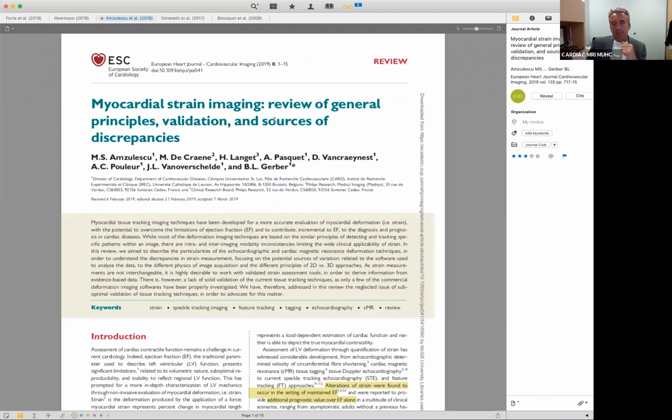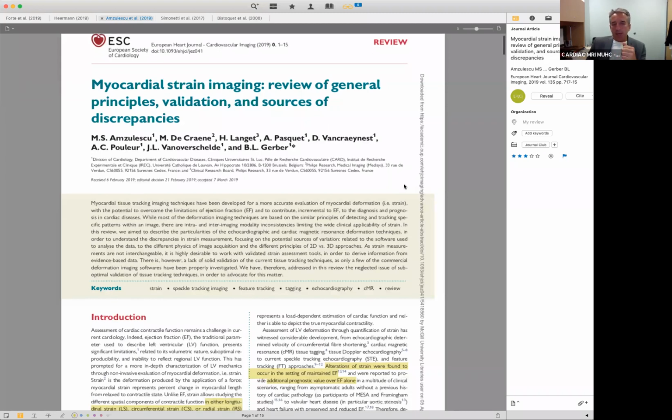However, the ejection fraction has its limitations. First of all, of course, it doesn't give any information on regional function, but also it's not really very quantitative. What you're getting is a fraction, but not the absolute volume, the stroke volume, which is important when you talk, for example, about forward heart failure. So ejection fraction sometimes doesn't give the entire information. You can have a patient with an ejection fraction of 75%, so almost supranormal, and still dying from heart failure if there's a stiff ventricle that is small, and so the stroke volume is so small. So that's why strain imaging may play a role here.